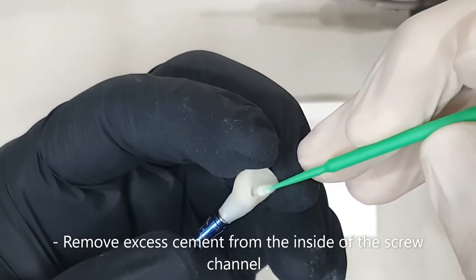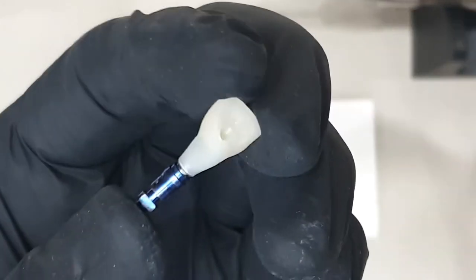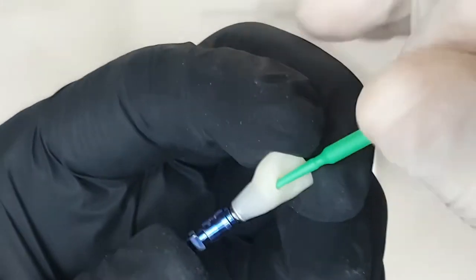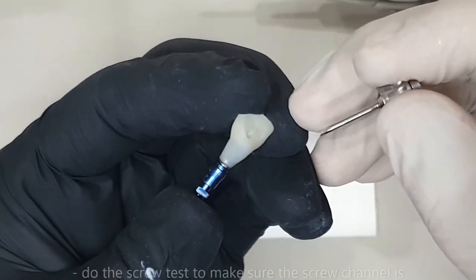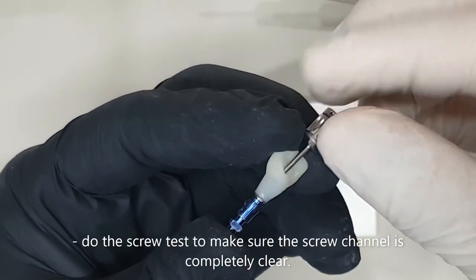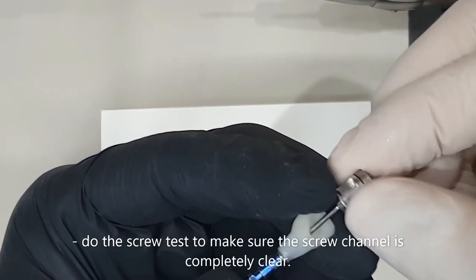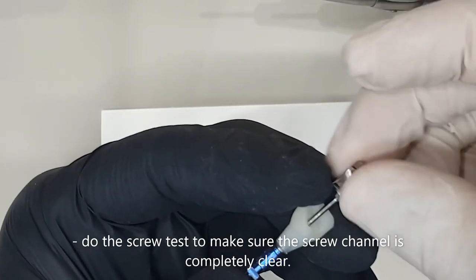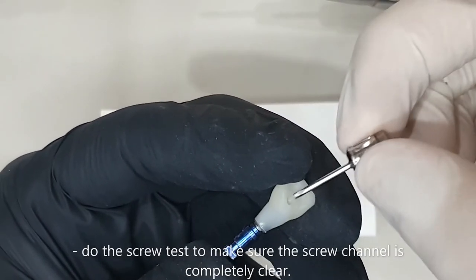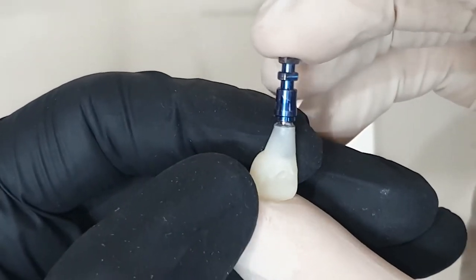I'll make sure to remove all the excess cement from the inside of my screw channel. I'll put in my screwdriver and remove the screw from its position gently, just to make sure that any excess is absolutely removed out of my crown. There we go — all nice and clean.